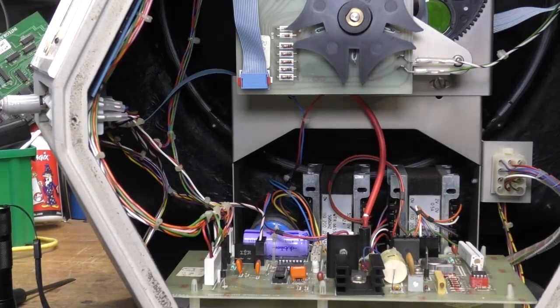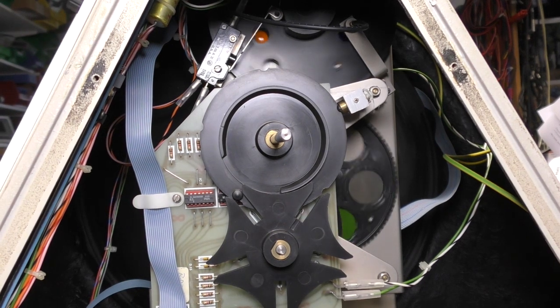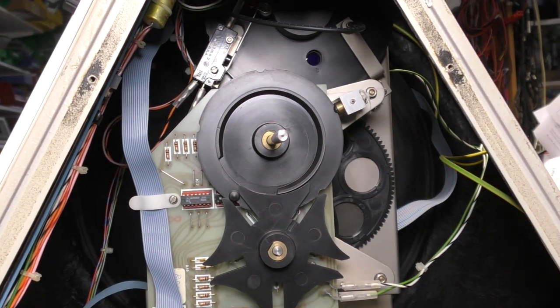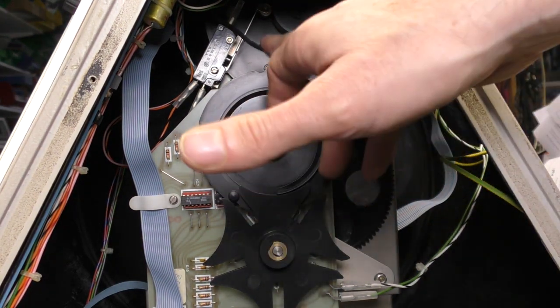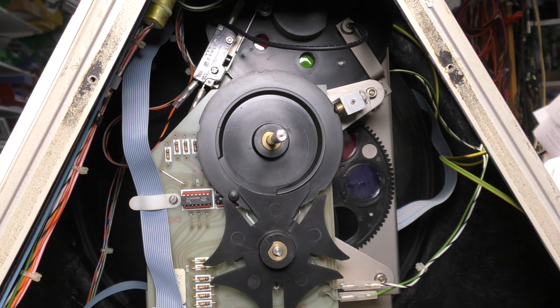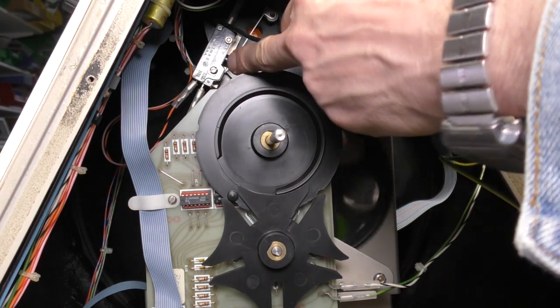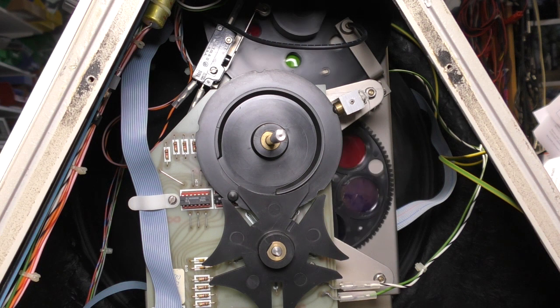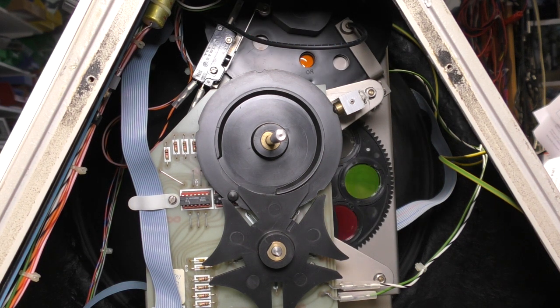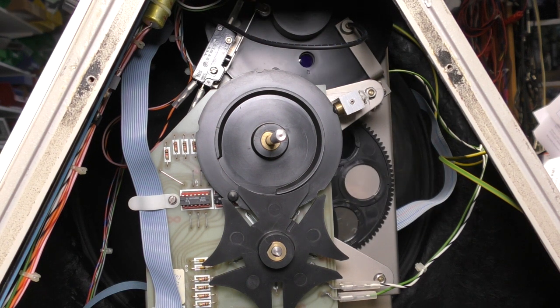So, taking the back cover off, and here we can see the colour wheel. The one at the bottom here is for the actual strobe, and then there's a little one at the top, and there's a fibre optic cable. I think that's feeding that colour indicator on the front panel. There's also a micro switch up here, which seems to only be operated on the blue section. I don't know if maybe that's to adjust the strobe power to produce more light with the blue filter, or there's some other aspect that's different. I couldn't see any obvious change in functionality.